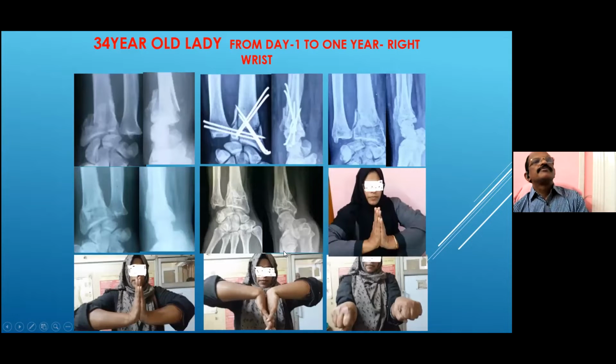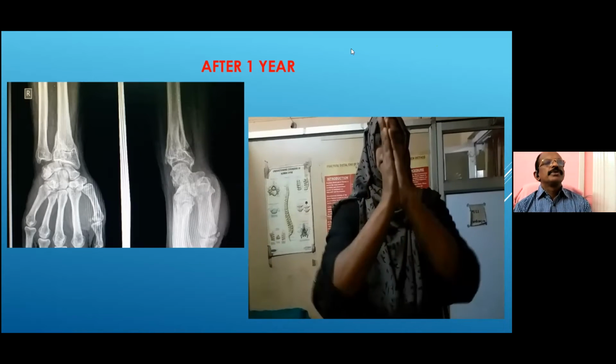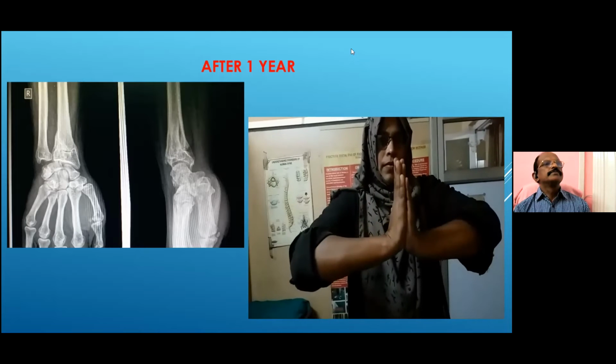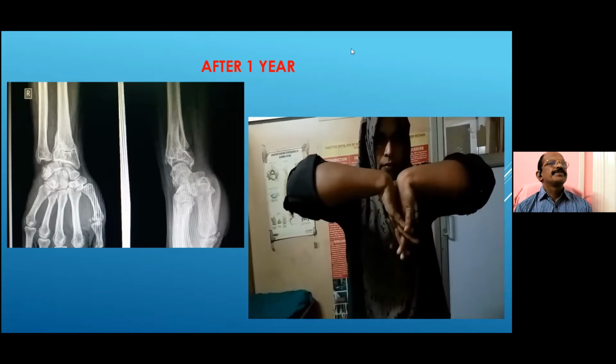The same person from day 1 to 1 year. You can see this X-ray at 1 year. The range of movement also is visible. After 1 year, the same person. You can see this range of motion. And also the X-ray is shown there. No metaphyseal collapse at all.